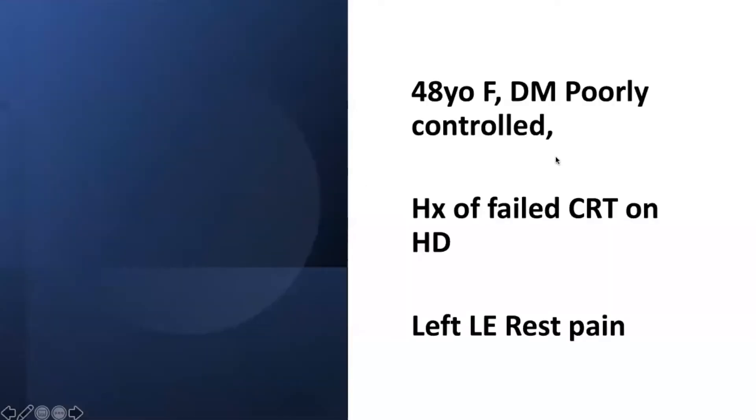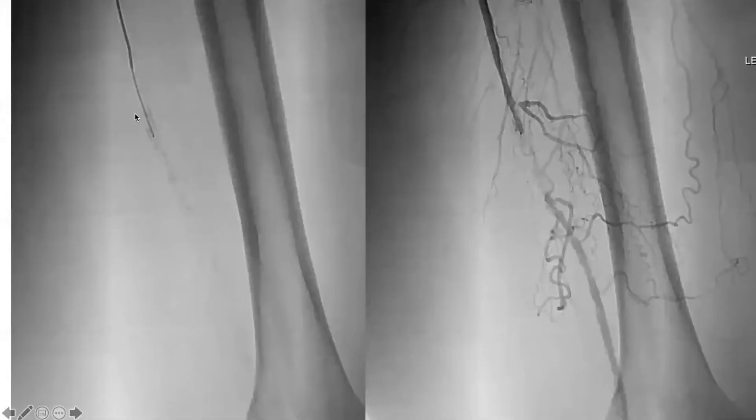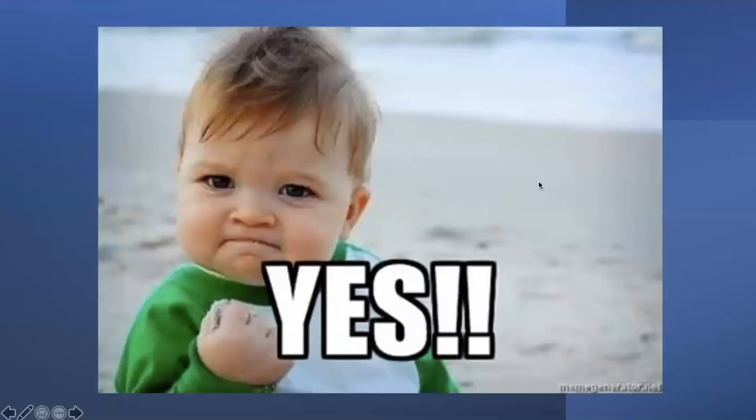This is a 48-year-old patient with diabetes, failed renal transplant, and rest pain. You can see the calcium I showed at the beginning of the lecture, and you can see the reconstitution a few centimeters after — so you get super excited because you think this is going to be a good case.